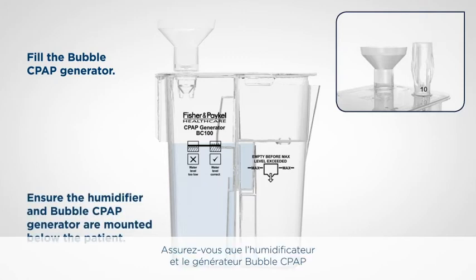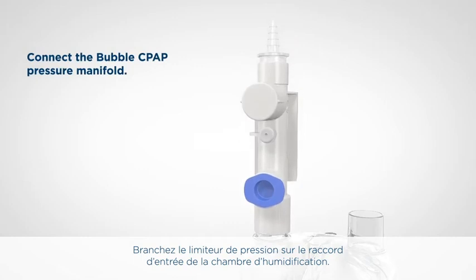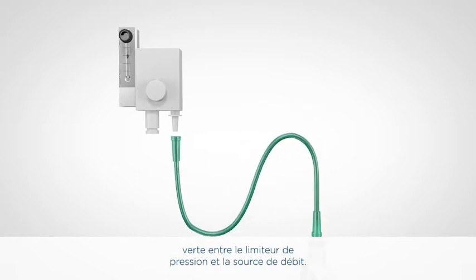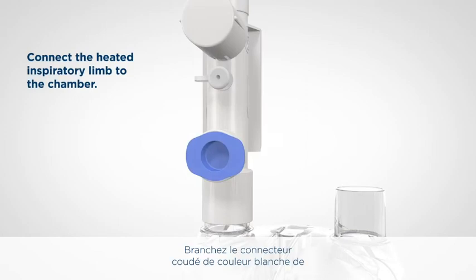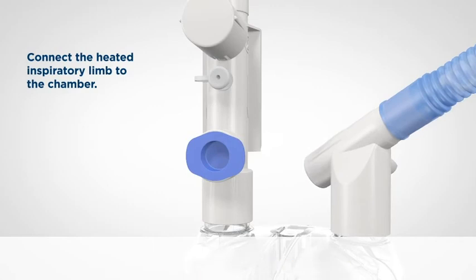Ensure that the humidifier and Bubble CPAP generator are below the patient. Connect the pressure manifold to the chamber inlet port. Connect the green oxygen tubing between the pressure manifold and the flow source.